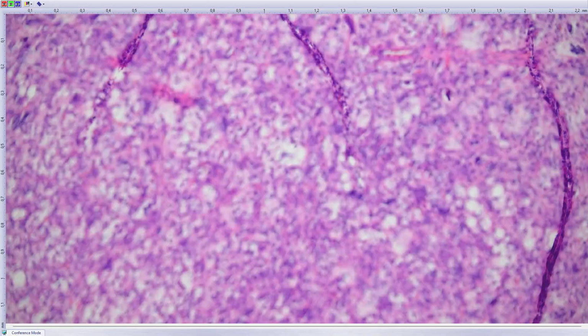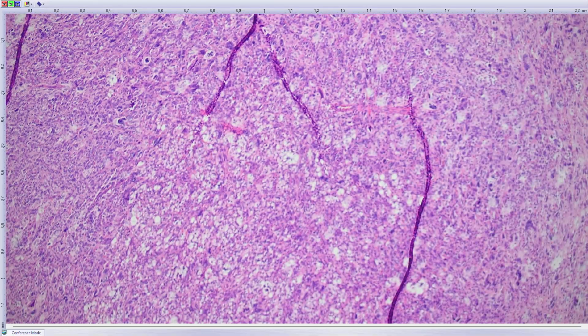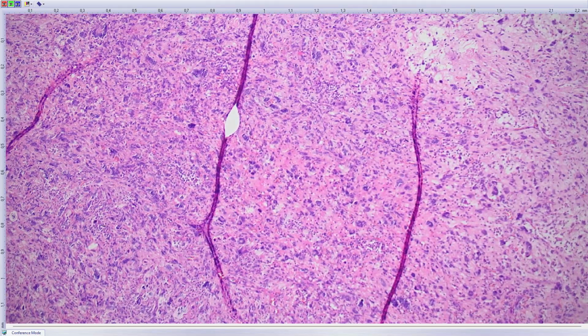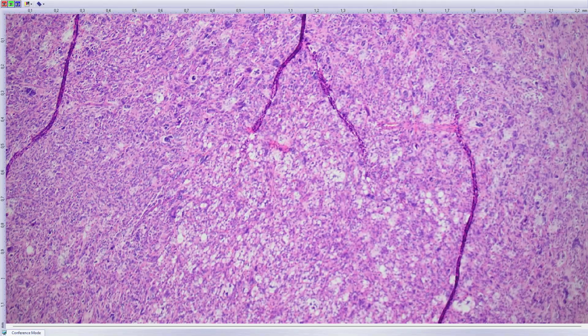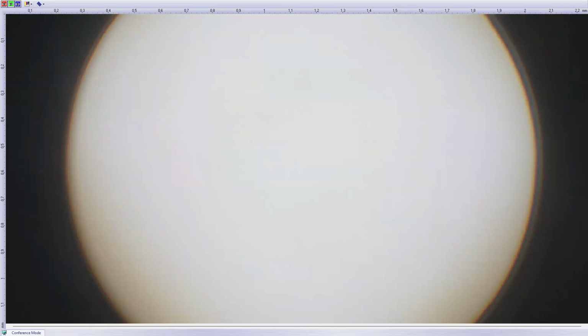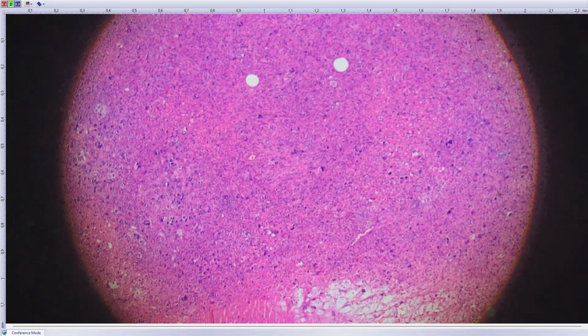So there is no doubt this is tumor going into adipocytic differentiation, and the rest of it is basically UPS-like morphology. So here there are essentially two differential diagnoses. It can be either pleomorphic liposarcoma or dedifferentiated liposarcoma. So you just do MDM2 immunohistochemical staining, and that was negative with positive control. So this is a pleomorphic liposarcoma.